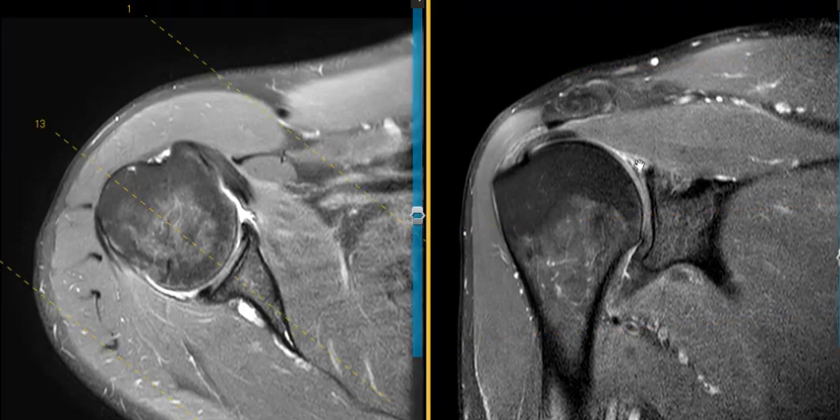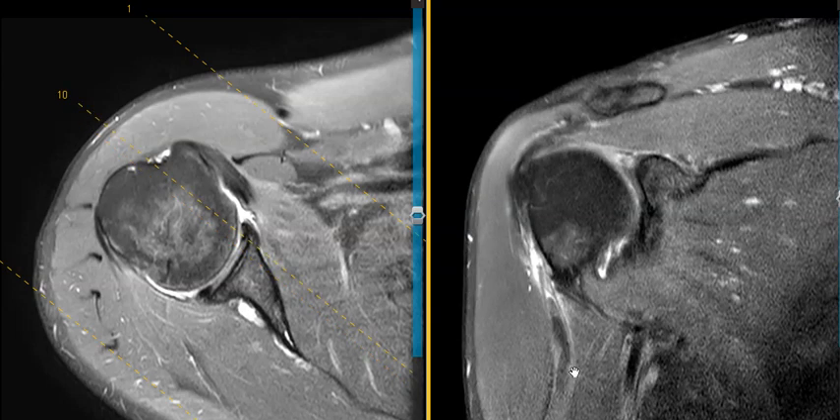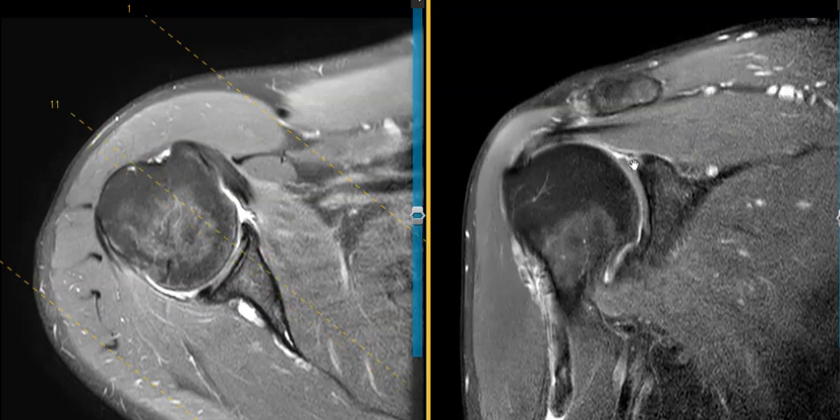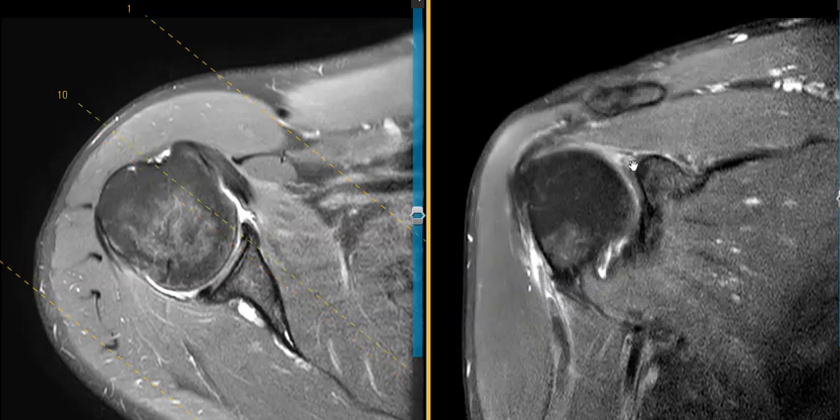When the patient tore the superior labrum they also tore the biceps tendon, which the doctor knew clinically. The biceps tendon goes from down here up over the top and attaches right over here on the labrum — where it attaches we call it the biceps labral anchor. This patient has a ruptured biceps tendon from that labral anchor, and instead of seeing a nice biceps tendon coming around and making a loop down, we see nothing — completely torn. This is the intra-articular portion, and it is empty.